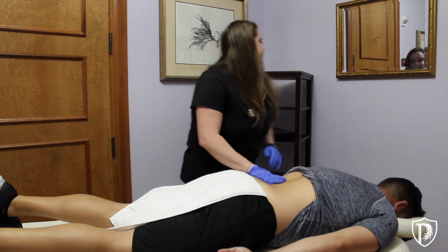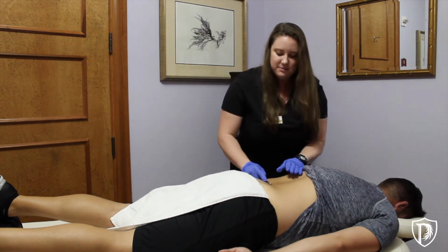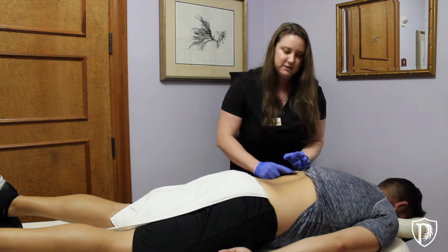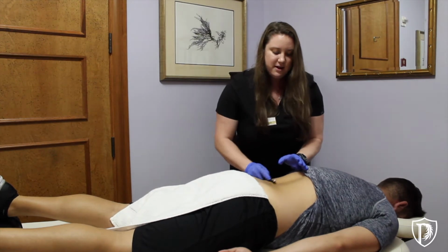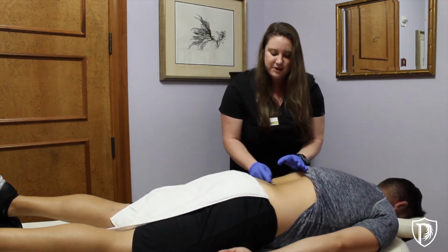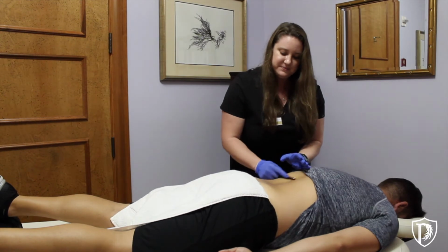So now that that's on, I take one of my instruments, and I use that round smooth edge here, and I'm just lightly gliding that smooth edge along the muscles of his spine. So I'm not digging in real hard, and that's the beauty of using these instruments, is that I can get to deeper tissues without having to apply as much pressure, because the tool gives me leverage. So it's more comfortable for me as a therapist as well as the patient.